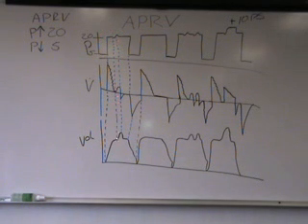And then on top of that volume that was already delivered by the change in pressure, I have more volume delivery because the person's breathing on top of the volume that was given with this first pressure gradient. So if I look down at the volume scalar, I see a little bit more volume being delivered on top of the volume that was already delivered.